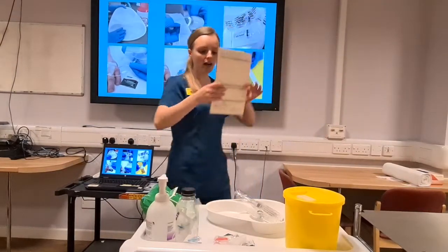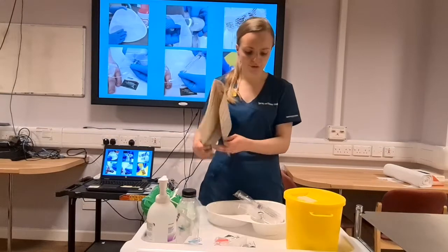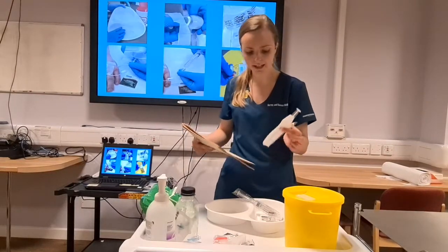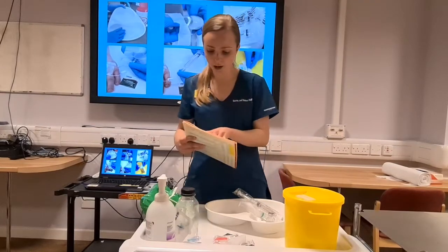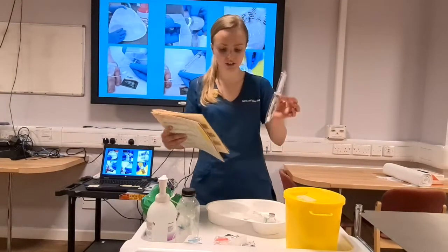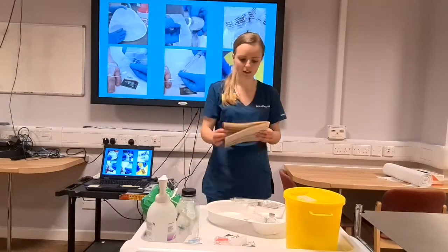So if I was the other member of staff, I would make sure it's the correct patient, making sure there's no allergies. Going through to the medication, so it is the correct medication, that is in date. It is the correct route, so my medication is bolus. The correct dose, did I say that? I think I did. Correct time, yeah. Water for injection, is this in date? Perfect. And 1 flush, and it's a cannula, so that's fine. It's 5 mils before, 5 mils after. So that is fine, and that is in date as well. Lovely. So I shall sign.